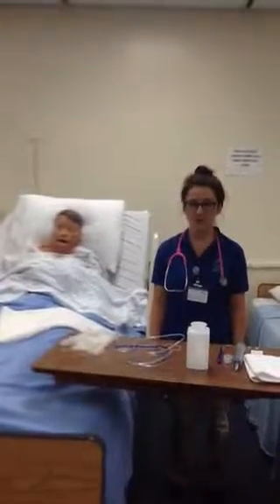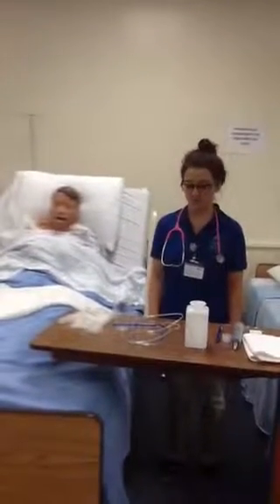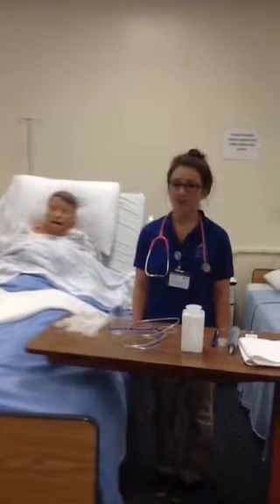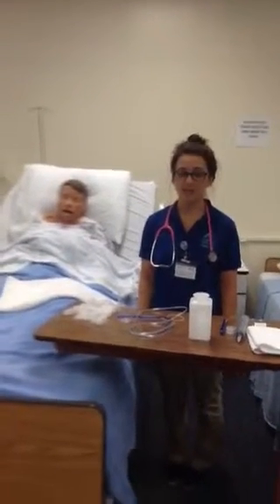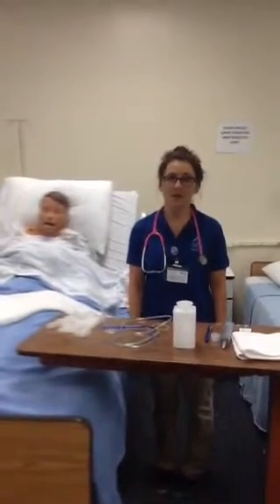Today I'm going to be demonstrating insertion of an NG tube as well as irrigation. Before beginning, I would check for physician's orders of the NG tube and the purpose of the NG tube. Today the physician would like a suction NG tube placed for decompression of the patient's stomach.